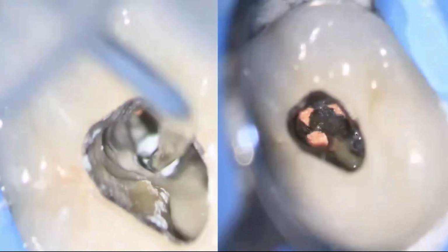So that's an image of just having placed the plugger into the orifice, and then once the plugger is placed, I can then place my Obtura tip into the joining canal. So the plugger basically is there to maintain that pressure. If I don't have the plugger there and I just squirt, it's just going to back up and kind of short circuit as opposed to going all the way down to the apex. It's going to come up the side of the joining canal, and I'm not going to get a dense fill.